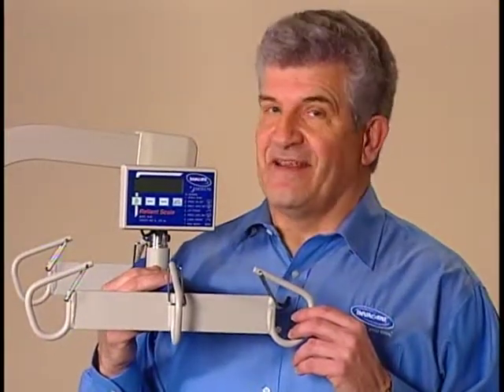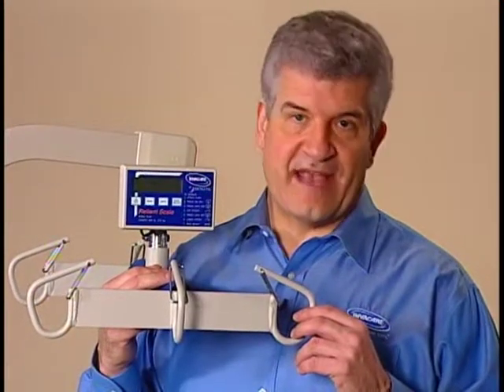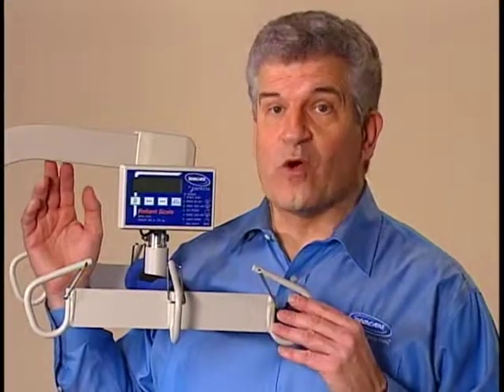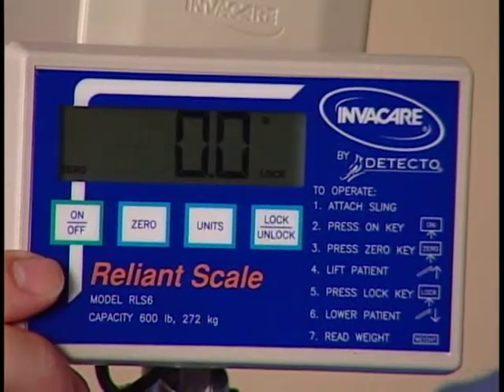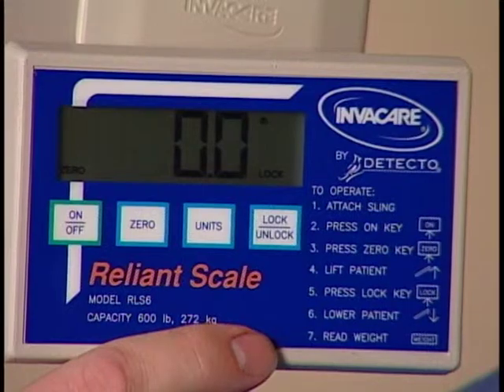Keep in mind that the resident's weight must not exceed the lowest rated capacity of any component — the lift, the sling, or the scale. The scale is easy to use with clearly labeled controls, an easily read display window, and operating instructions printed on the face panel.